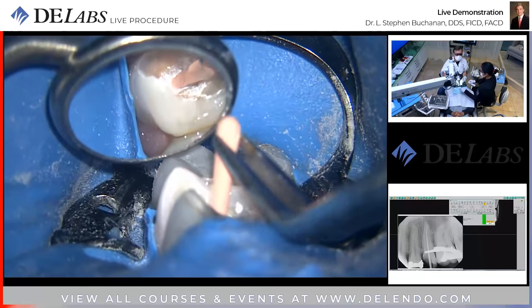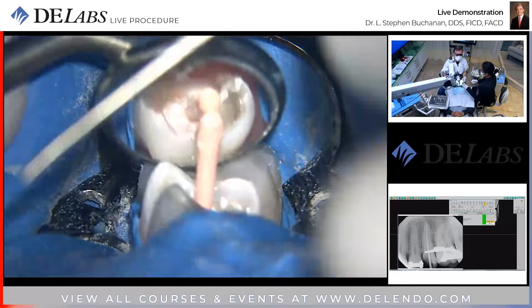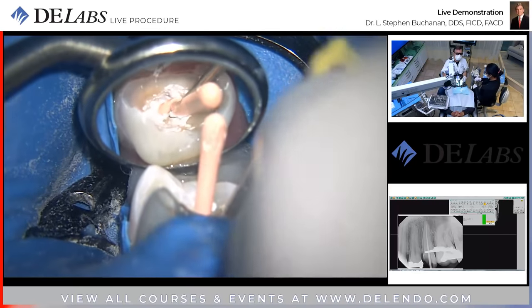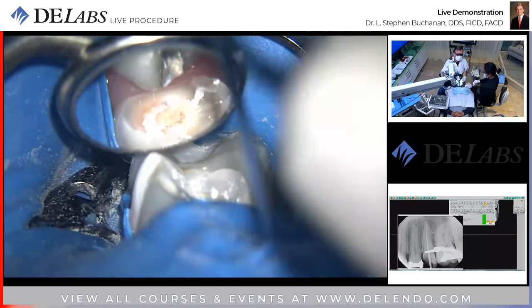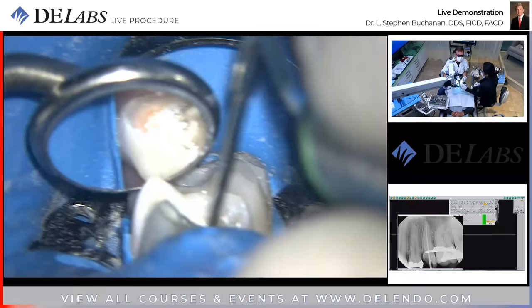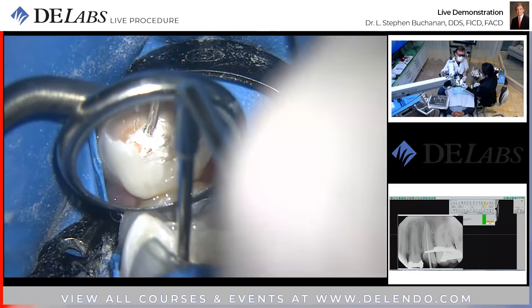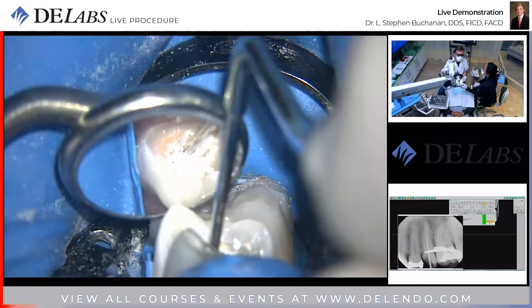Backfill cones are the same exact geometry as the plugger. I'm going to sear this off again, 1001, 1002, 1003. It shuts off automatically at 1004, at 4 seconds. Rubber rebounds, so when you're condensing it, hold a firm pressure. Let it set. Remember that the plugger is a heat sink.